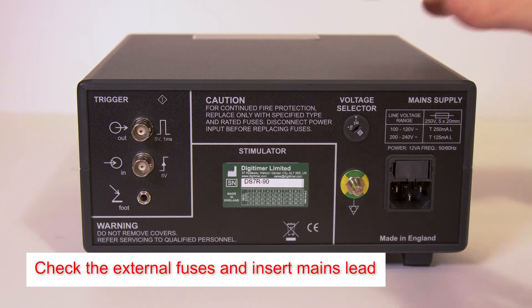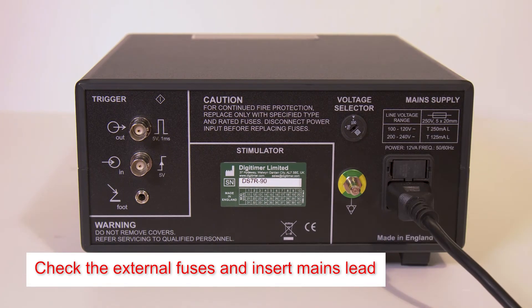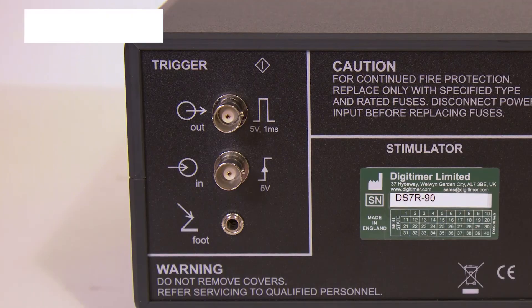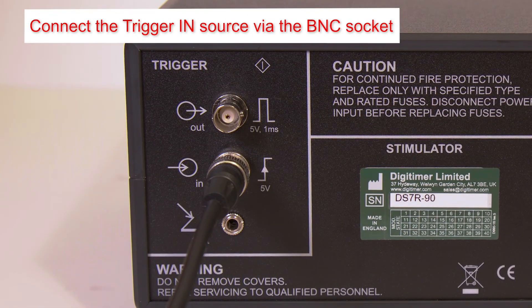Before first use, check the mains fuses are appropriate for your supply voltage and insert the mains lead. If using an external trigger source, connect it to the trigger in socket using a BNC cable.